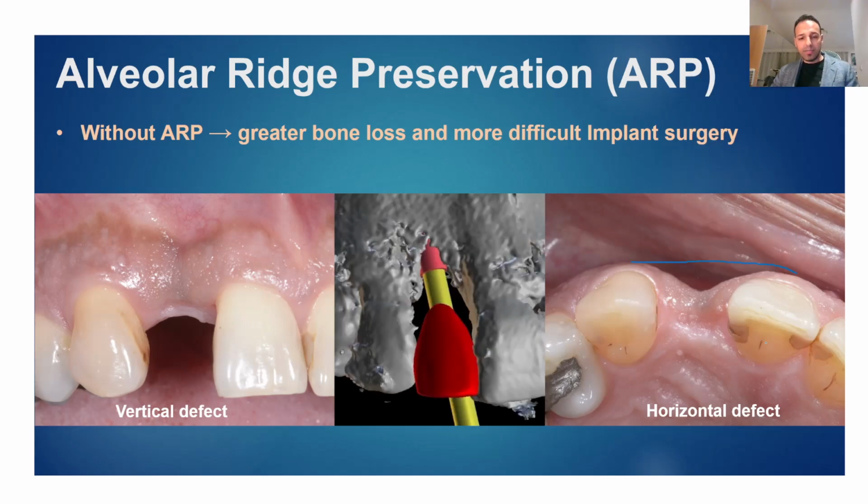And you can see if we have to plan an implant at the ideal position, there's a certain amount of height, as you can see in the yellow, between the implant and the crown. This dimension usually has to be a certain amount. So if we have to place the implant in the right ideal position, we're going to have to place it supracrestal, which isn't ideal either.